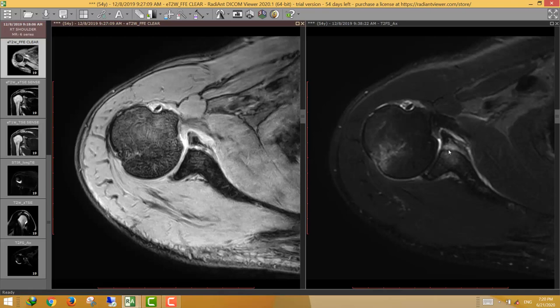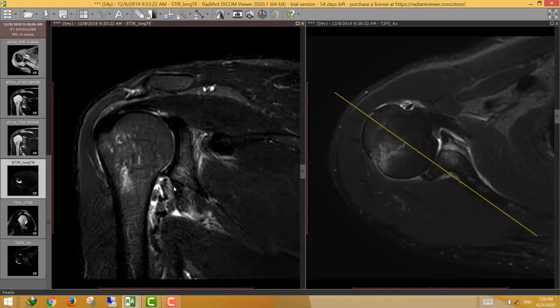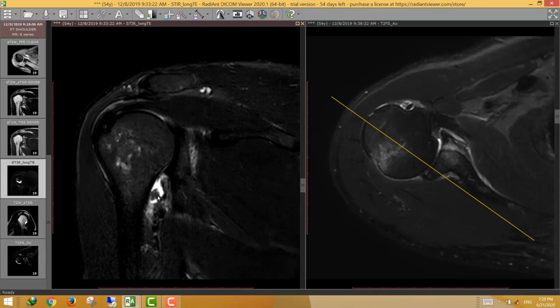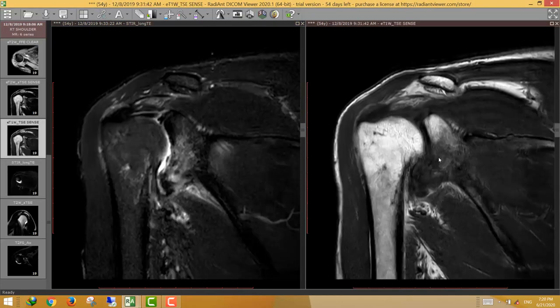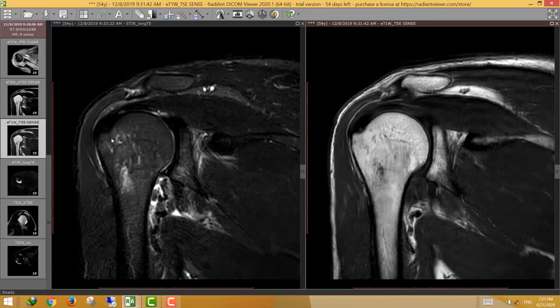In cases of shoulder dislocation and Bankart lesion, look for the underlying osseous fracture and the posterolateral humeral head for Hill-Sachs. Also look for the inferior glenohumeral ligament. Here there is disruption of the inferior glenohumeral ligament from its humeral attachment, with fluid in the axillary recess spilling into the axillary region — confirming humeral avulsion of the inferior glenohumeral ligament (HAGL lesion), common in shoulder dislocation. The joint effusion appears relatively high signal on T1, indicating hemorrhagic joint effusion.